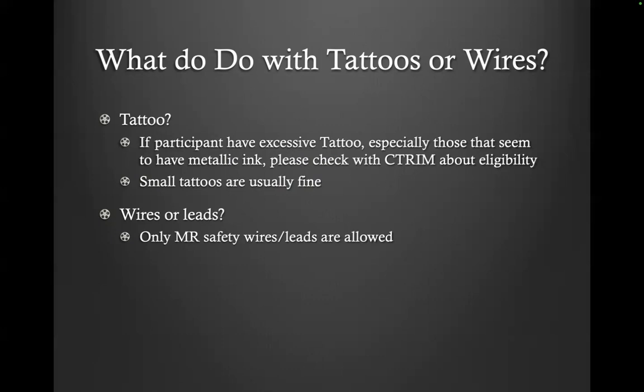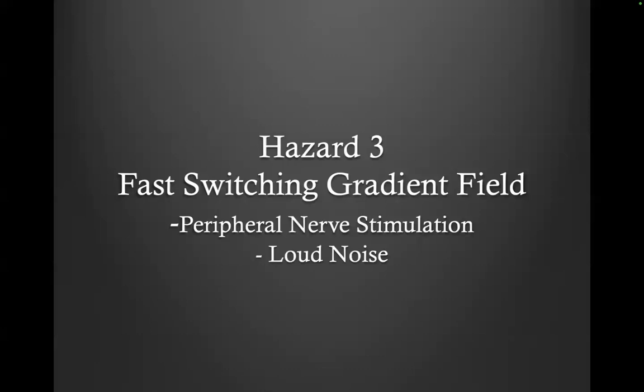We will take them out of the scanner immediately, instead of having them last through the end of the scan and causing burns. Also, only MRI-safe wires and leads should be allowed, and only tested wires should go in there.